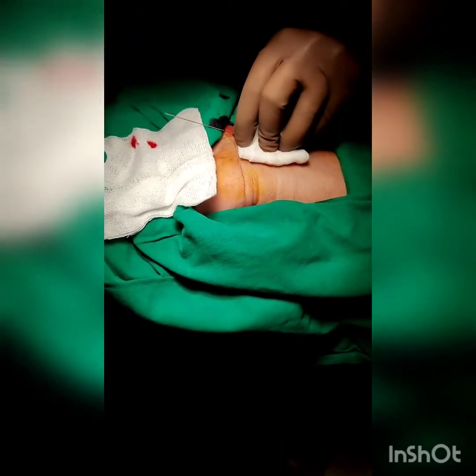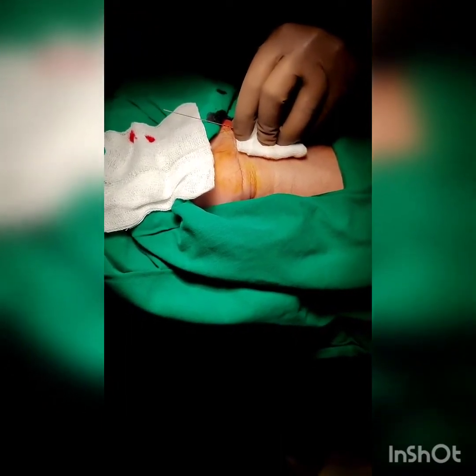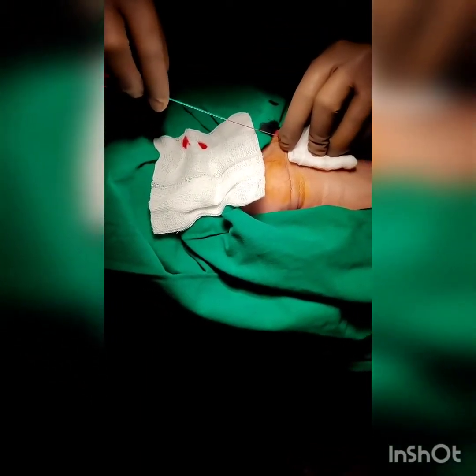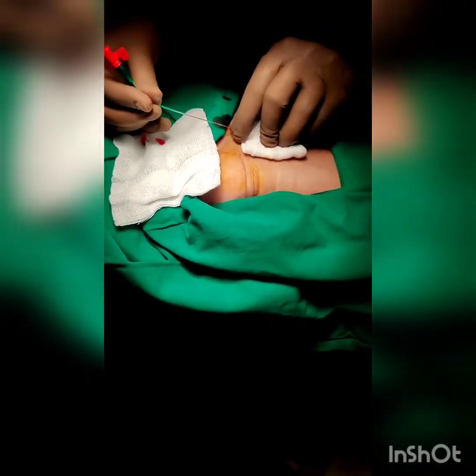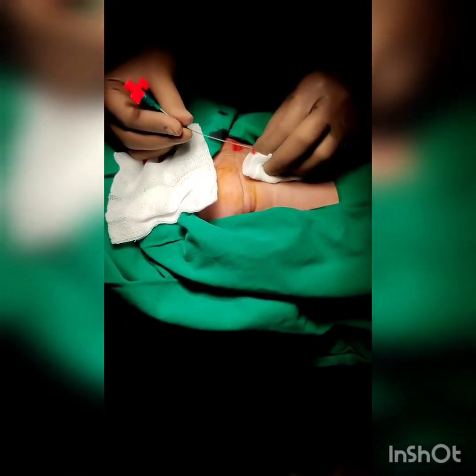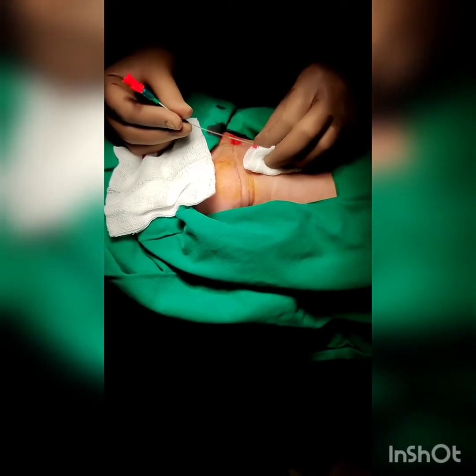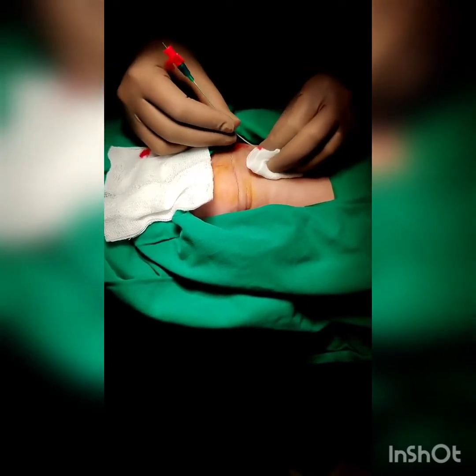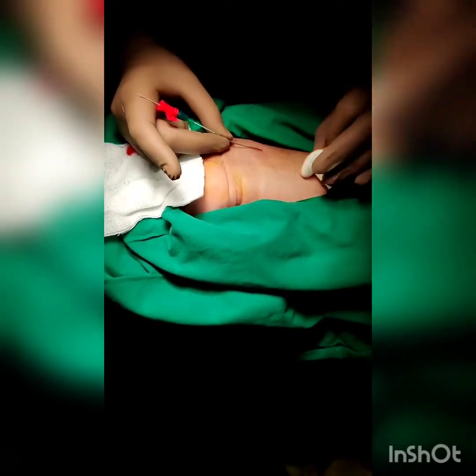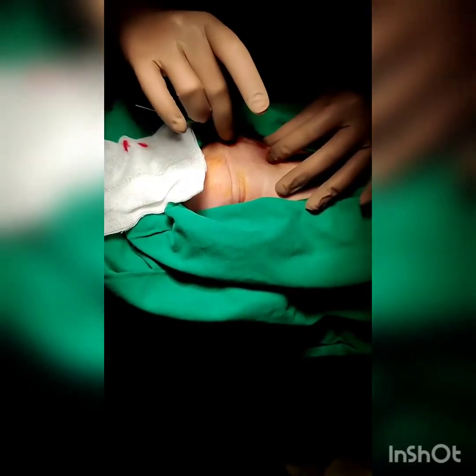The introducer needle is then removed over the guide wire and disposed of in a sharp needle container. The sterile arterial catheter is now guided over the guide wire into the artery, making sure the guide wire tip is held at all times, as you do not want to lose the wire in the arterial circulation. The entire length of the arterial catheter is introduced into the arterial lumen.